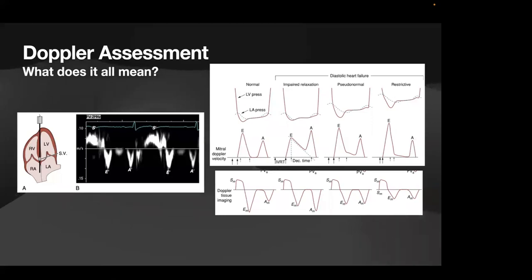And as you can see, as your diastolic grade increases, your IVRT, your isovolumic relaxation time, is going to change. It's going to widen, then it's going to go back to normal, then it's going to be smaller, okay? And similarly, your E's will go up, and then they'll go down, and then they'll go back up again in a pattern that's well described.